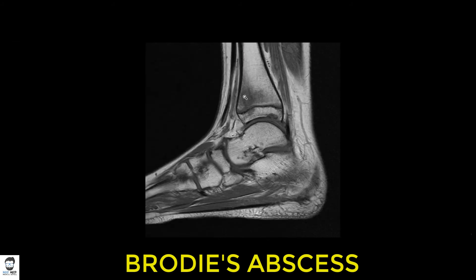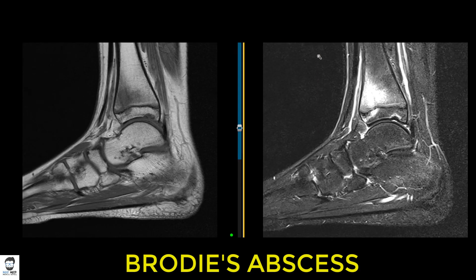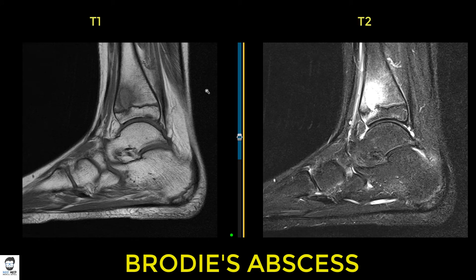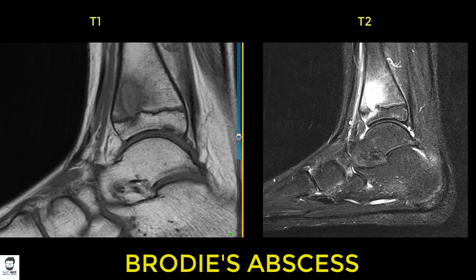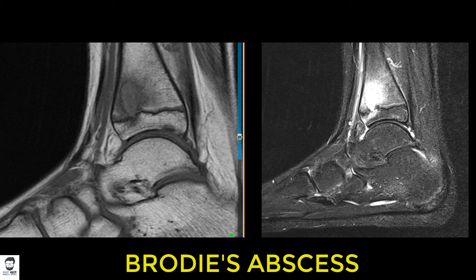On T1 the bone is white and the lesion appears black, in contrast to T2 where the lesion is white. Comparing the T1 and T2 sagittal images side by side: on the left (T1) the bone is white and the lesion is black; on the right (T2) the bone is black and the lesion is white. A useful mnemonic is 'World War 2' — water is white on T2.